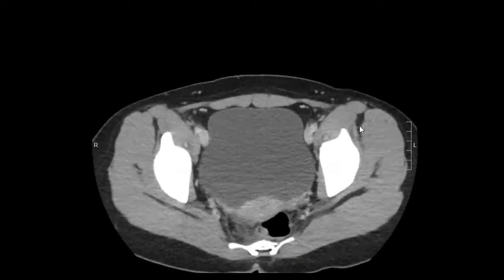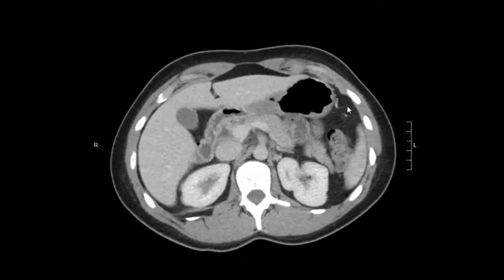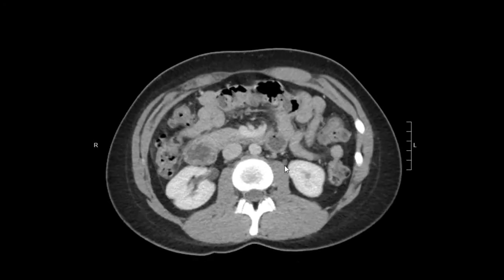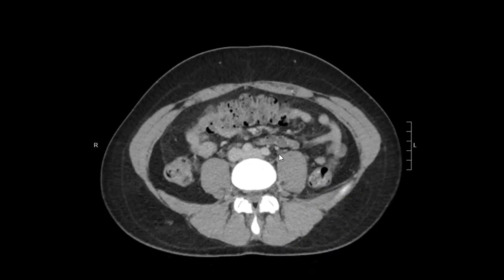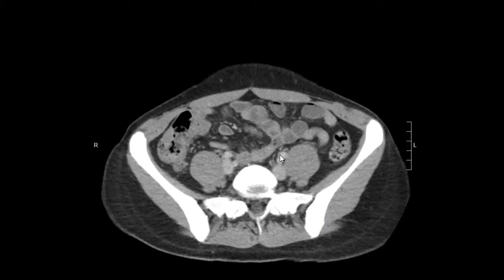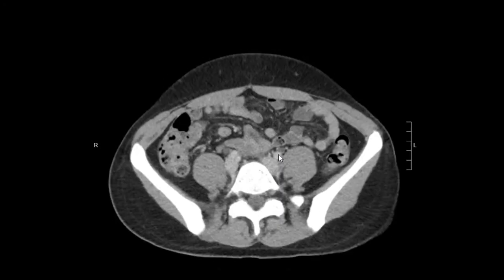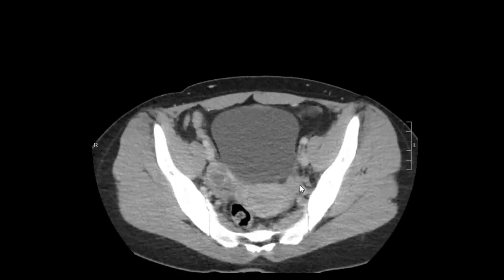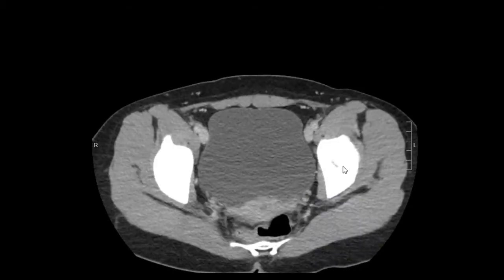We can do the same on the left side. We find the ureter and we follow it distally. No kind of abnormal dilation. It's normal to get a little bit dilated as it crosses into the pelvic brim.